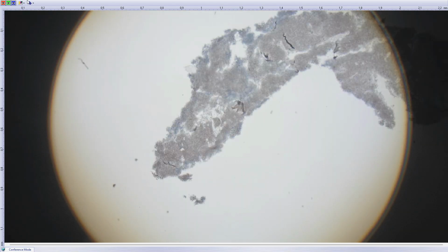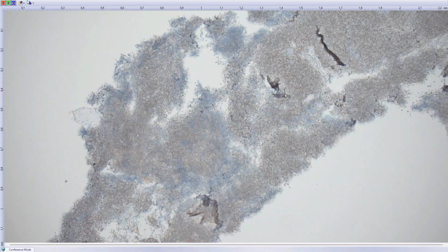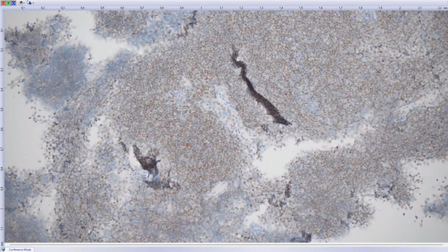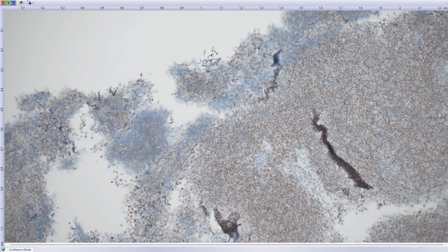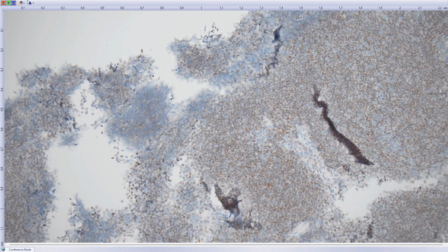In addition, using TDT antibody, you can confirm that indeed these are TDT positive primitive lymphoblastic cells. So it's not lymphoma, it's not carcinoma, it's Thymoma, right?